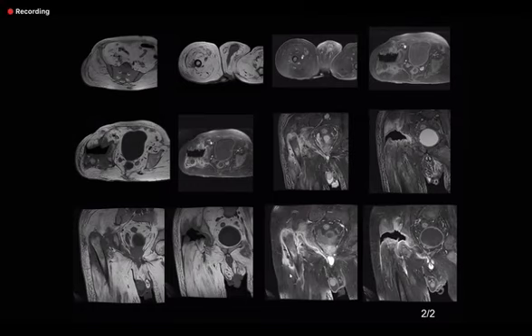So this concept is asked in the exam many a times. In head and neck, subperiosteal abscess of the orbits, or in the spine. If something is totally enhancing, there is nothing to be drained. In this particular case, there is extensive phlegmon. You can use the word when muscles are enhancing or they are high signal on STIR, call it myositis.